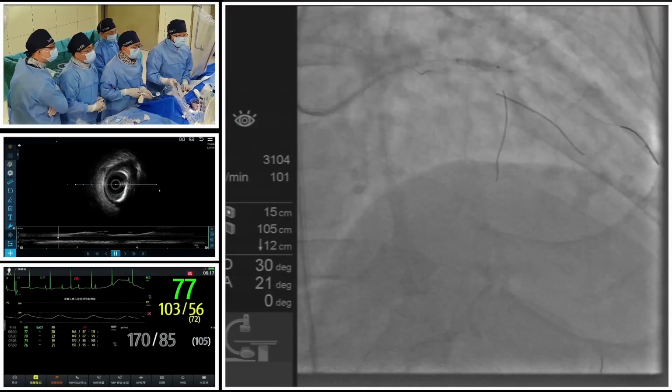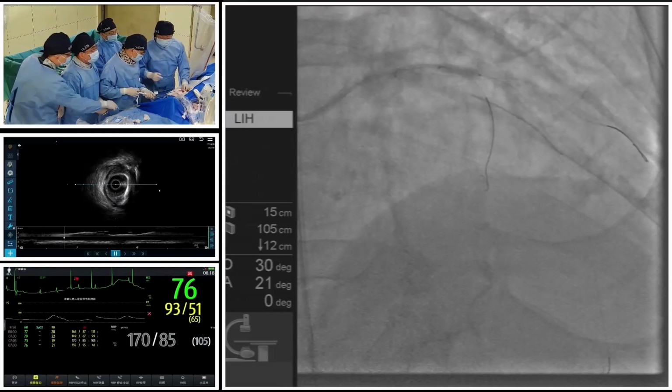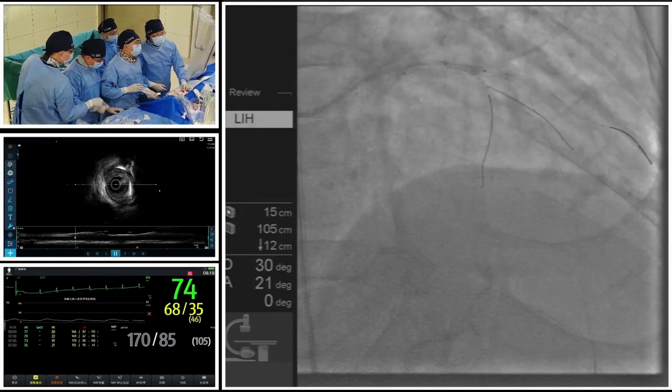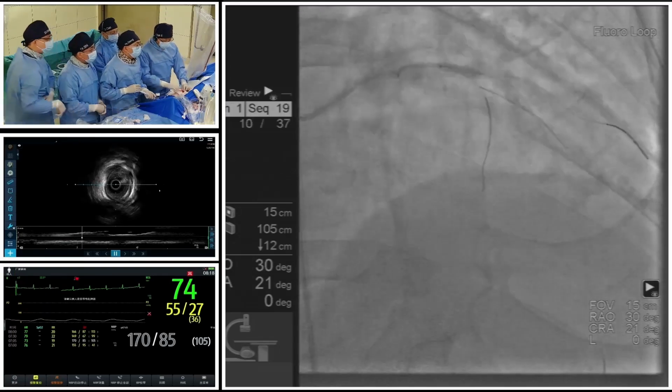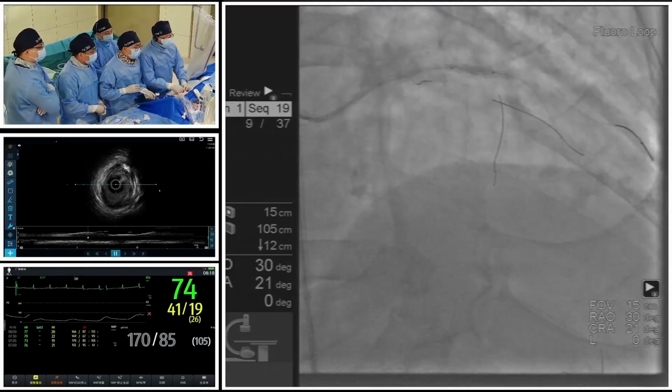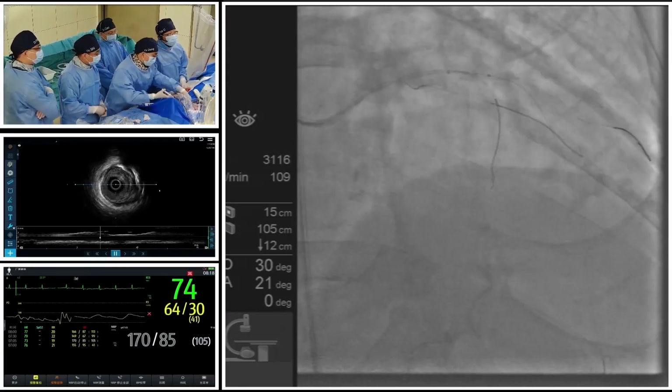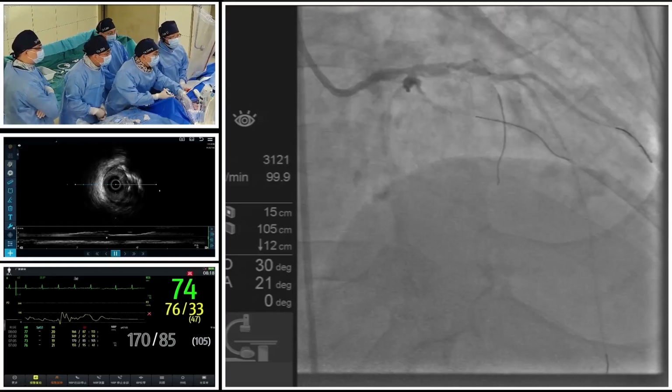Okay, done. So the first 10 pulses. Okay, test a little bit. We must be careful with the pressure, please.